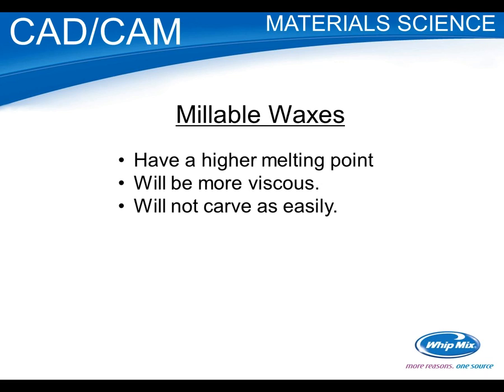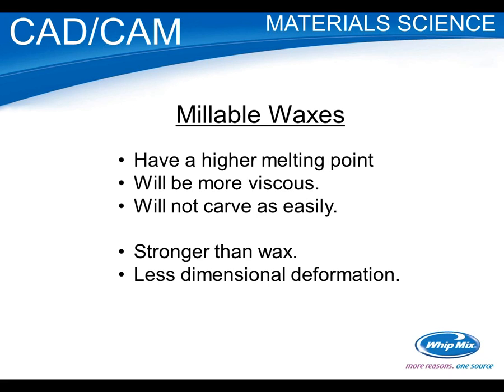The others won't carve as easy. It's a little tougher material. Still carvable, but not as easy as your classic wax. Now, on the other hand, it's much stronger than normal wax. It has less dimensional deformation. It's very stable material, and it has similar casting properties.